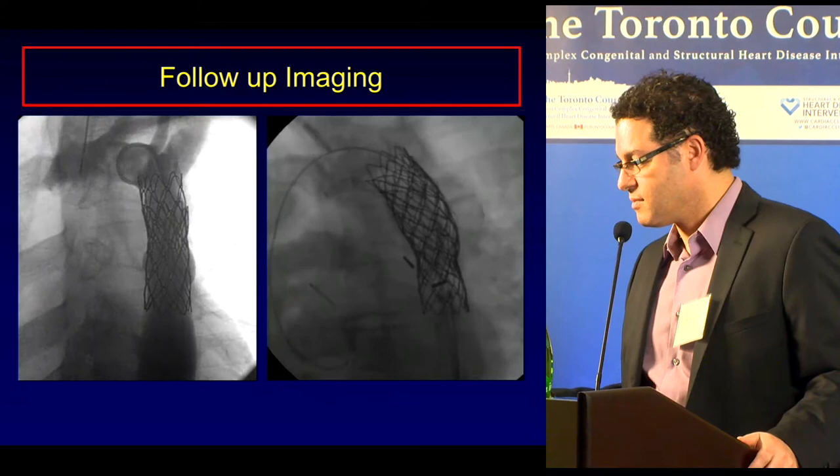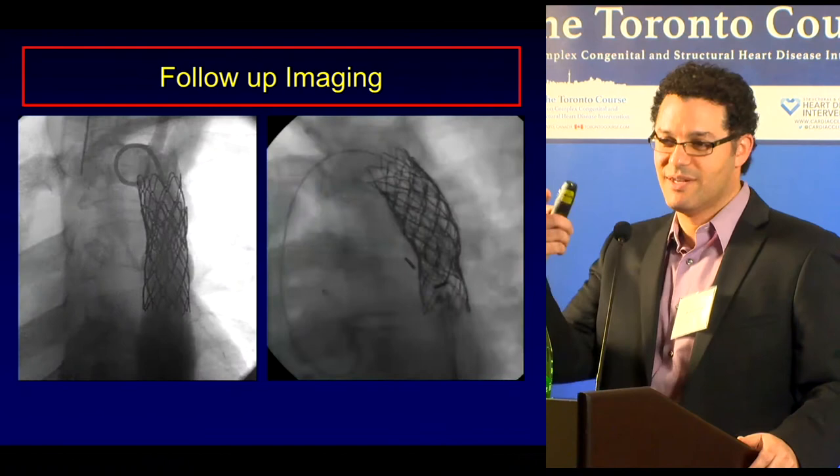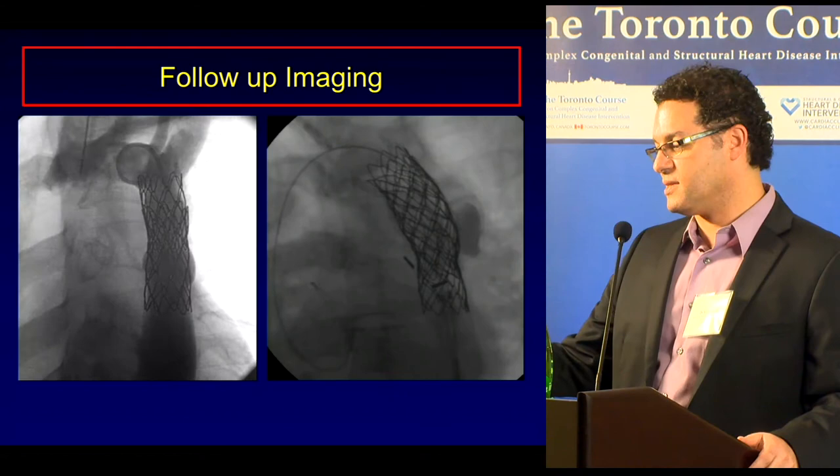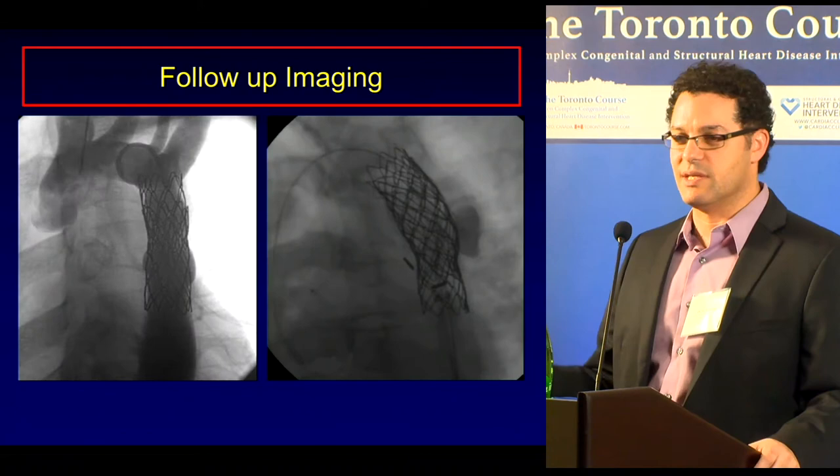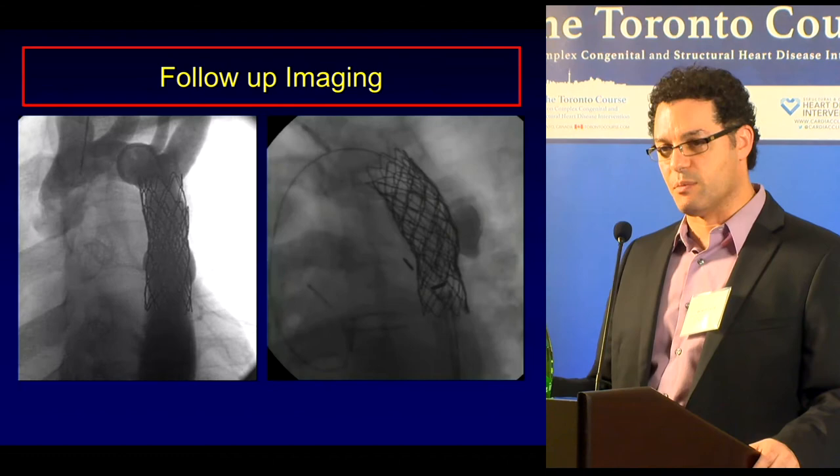This was a case from when I was a fellow, and it shows you how we did those. This was a patient who had a bare metal stent. This is now three covered stents in. Once we figured out where it was, we did a high pressure balloon, got whatever calcium or spicules were out of the way and stopped rupturing the Gore-Tex, and used another covered stent. Four covered stents finally sealed this thing off. But unless you follow these up, you aren't going to know what you don't know, and that's why I don't think that the completion ever exists.